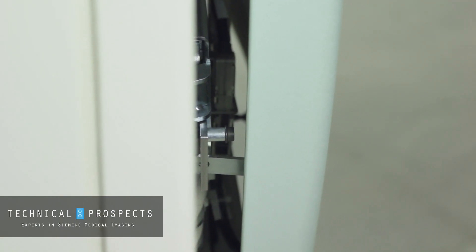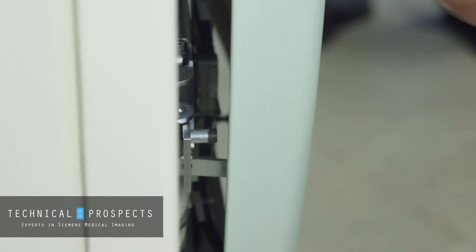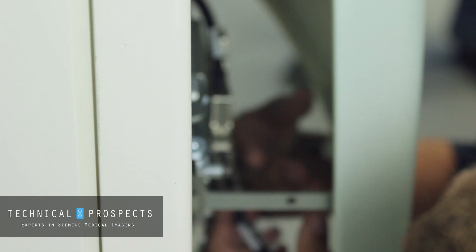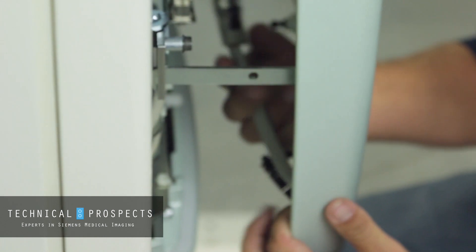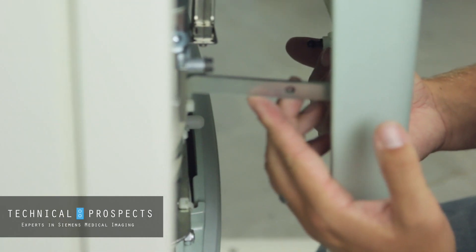Now we're at the point where we want to start lifting the front cover to access and do our service job. There are a few cables here — the best way is to come up from underneath. These cables have to be loosened because they go up with the front cover. There are two cables there, and lastly there's a latch that'll lock it if you don't release it.